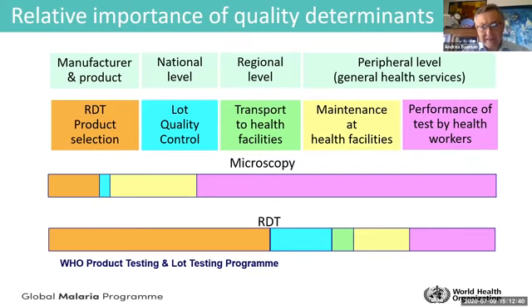And this is just a very quick summary of the major determinants of quality, showing a comparison between microscopy and RDTs.